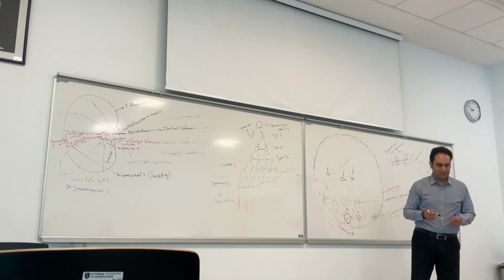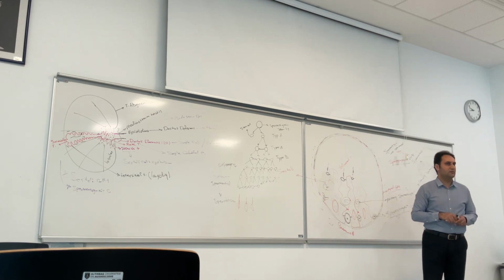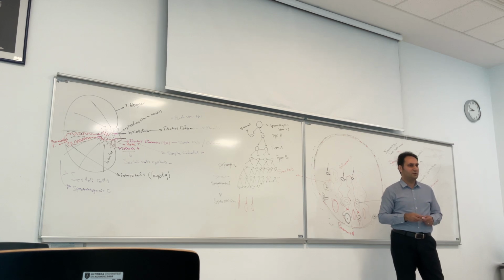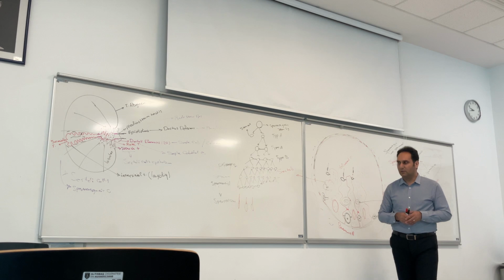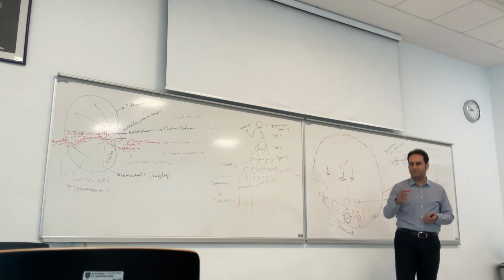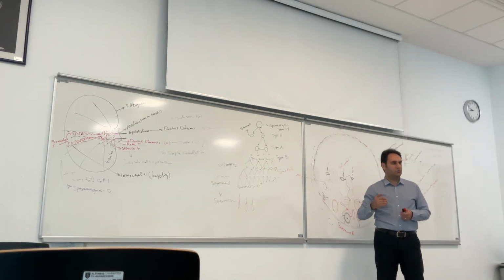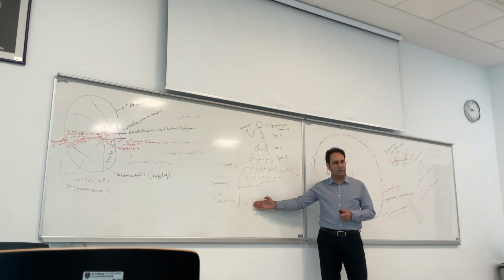In these stages, in the apical side of the cell cytoplasm, you can see the acrosome formation. Golgi forms the granules, acrosomal granules, and then these granules merge with each other and form the acrosome structure. Mitochondria and other organelles migrate to the opposite side of the nucleus.